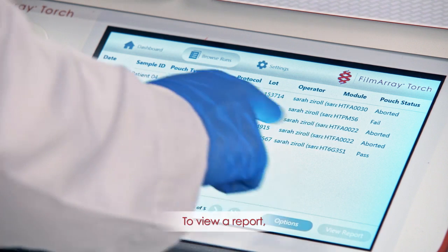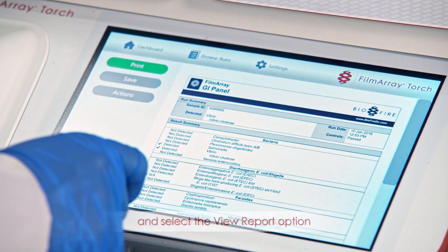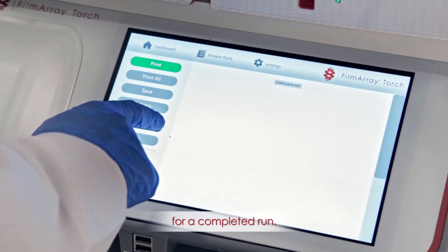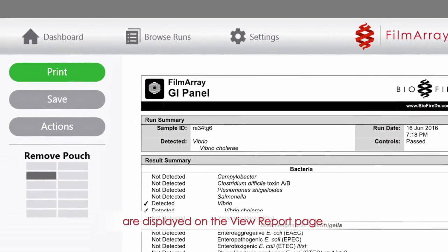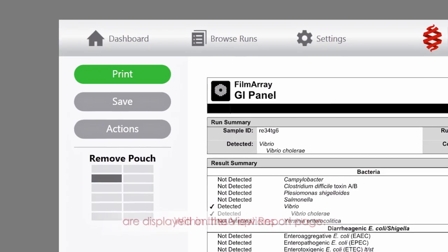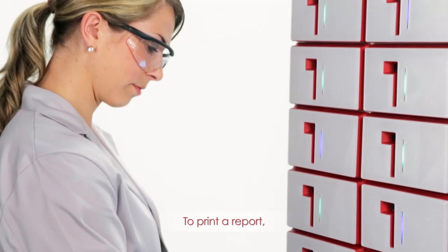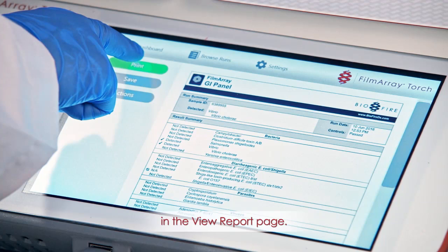View Report. To view a report, highlight the desired run and select the View Report option on the Browse Runs page, or select the module box for a completed run. Report menu. The options for each report are displayed on the View Report page. Within these options, you can print or save a report. To print a report, select the Print option in the View Report page.